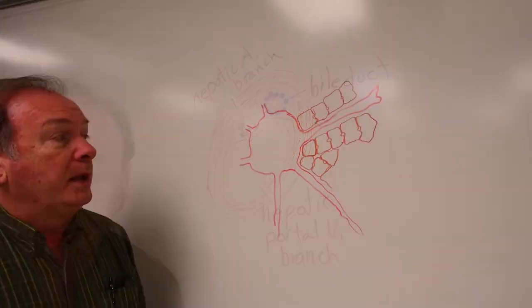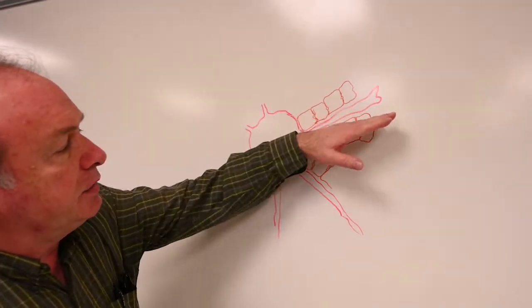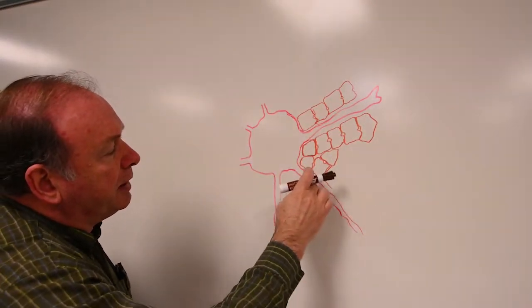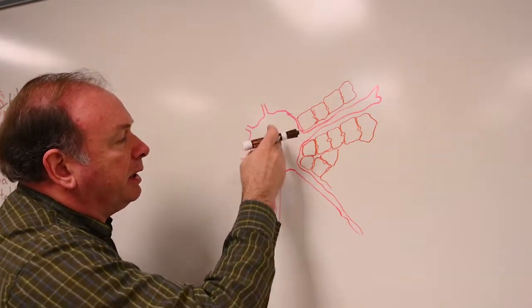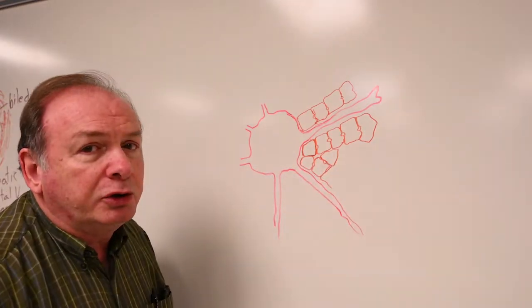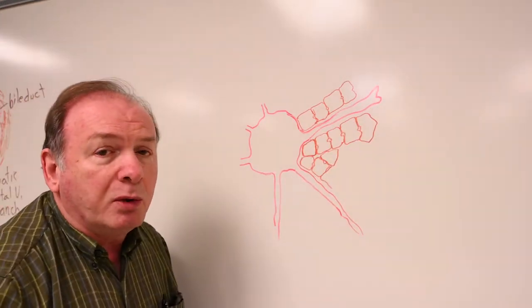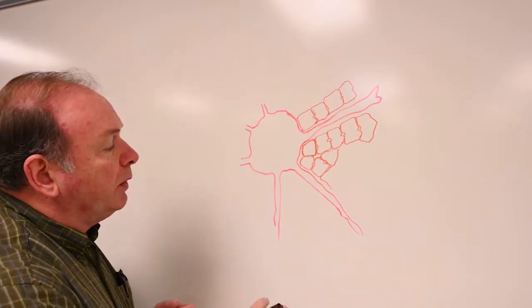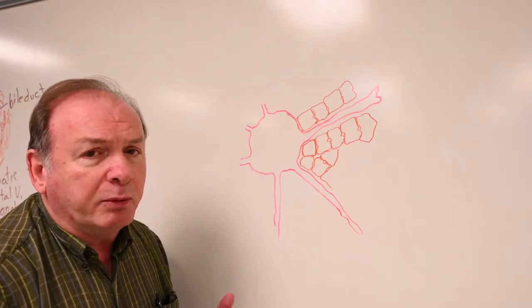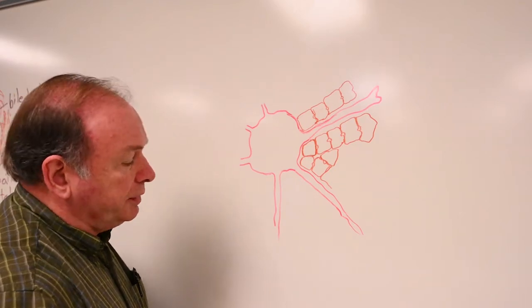liver lobule. In this picture, I've got the central vein here, and around that central vein, you're going to have plates of hepatocytes that radiate out like spokes of a wheel, and then there will also be the sinusoids, the blood sinusoids that lead into the central vein, coming in from all directions around it. So there's a very distinct radial pattern to a liver lobule. Out at the very outsides of the lobule will be locations with these portal triads we just talked about. So your blood supply leading into these sinusoids, that blood comes from both hepatic portal vein and hepatic arteries that feed the blood in toward the center.